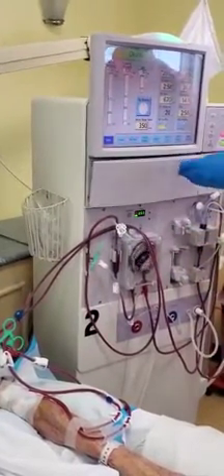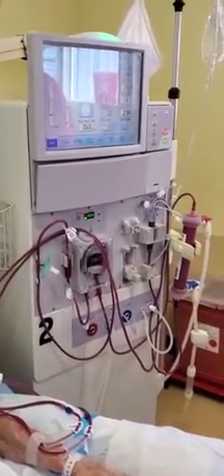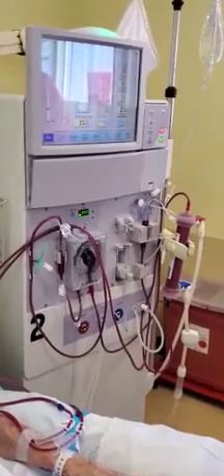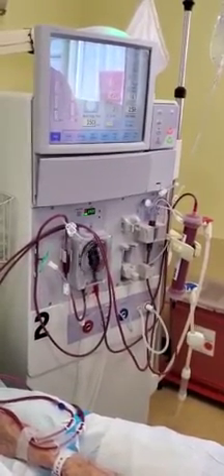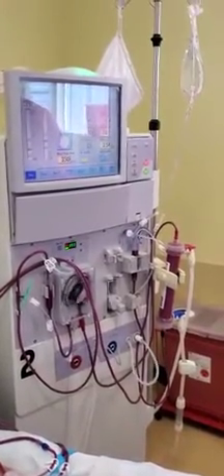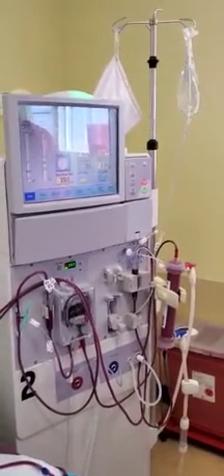The technician was a bit cautious in increasing the blood flow — he went in increments of 50. That's a safe way if you want to be extra cautious, and if your protocol says that's what you do, that's what you do. Most technicians will do that just as a precautionary measure. We can see her blood flow rate is at the prescribed rate, with arterial pressure at negative 170 and venous pressure at 140 — that is perfect.